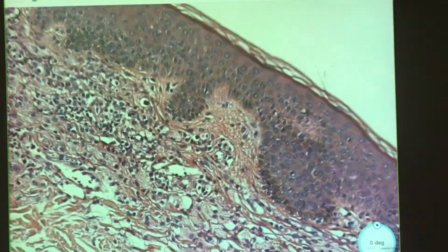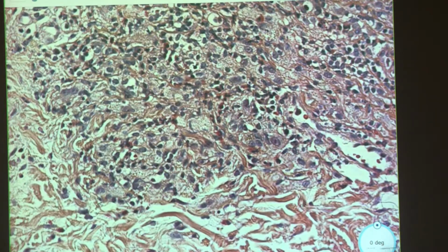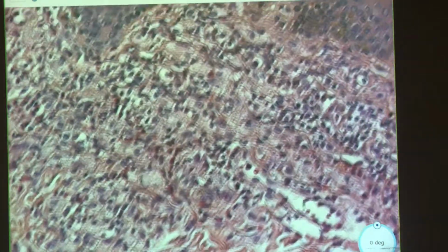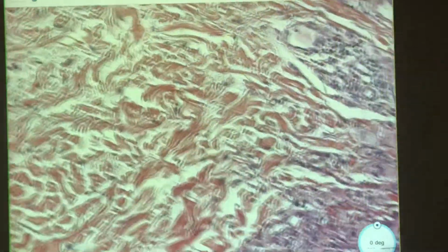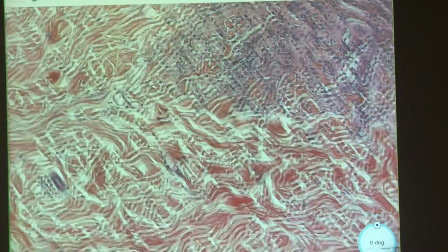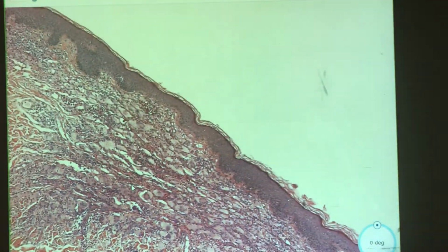So there's definitely some inflammation going on. These cells, I think, are lymphocytes, maybe. Yeah, maybe. There's a few. I think there's a couple EOs in there. And then that's about it. It looks like a pretty old slide. But anyways, okay, so what are you thinking with this?